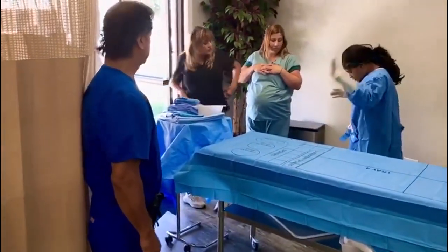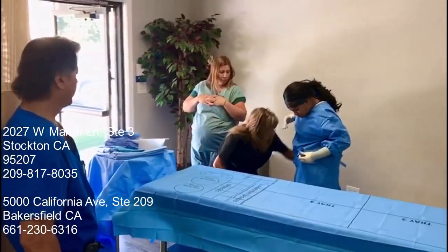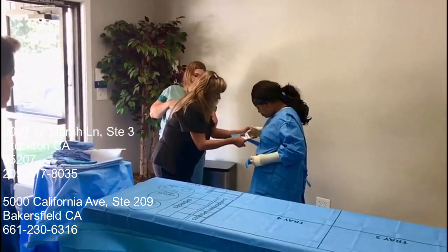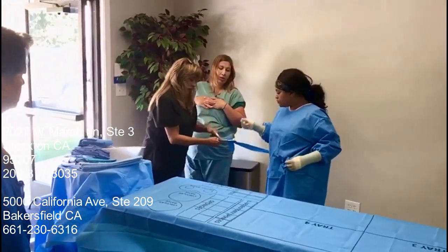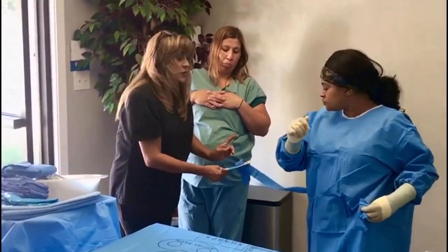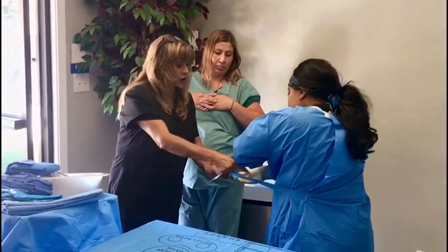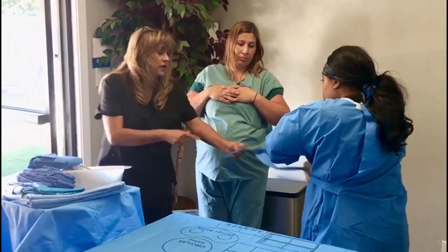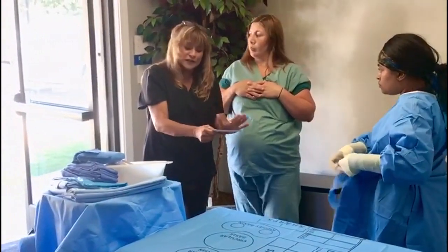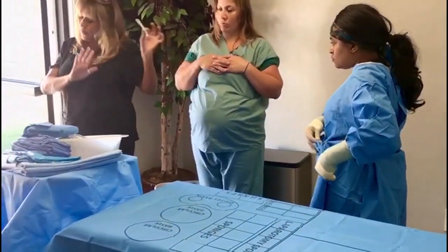Left hand on the string — tap the left hand on there, secure it right there. With just your left hand securing that and your right hand grabbing that, hand it to me. I'm going to touch on the area that I can touch on. If I was to touch here, I'm too close. So go ahead and spin, and then with your right hand, go in the crook of your left arm and grab that string away from that card — closer to you. This is way better technique to reach in and grab that way. Because if you grab too close to the card, your nurse might — even though you didn't contaminate — she may call you on it. So if I grab from here and pull it closer to me, I'm nowhere near that thing. Can't anybody yell.